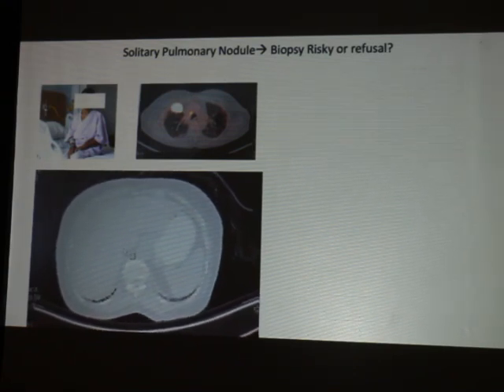On the chest X-ray, her physician detected a nodule in the lung. Since the lung was highly damaged, even a biopsy by the intervention radiologist was ruled out because of the high risk of complication. So we can see on a PET scan there was a nodule in the right apex.